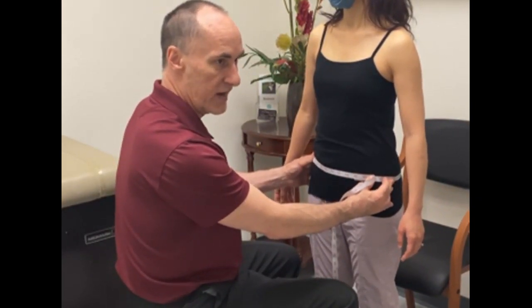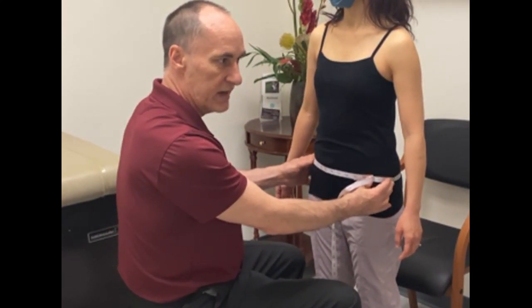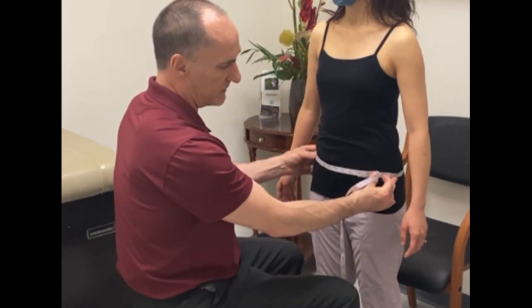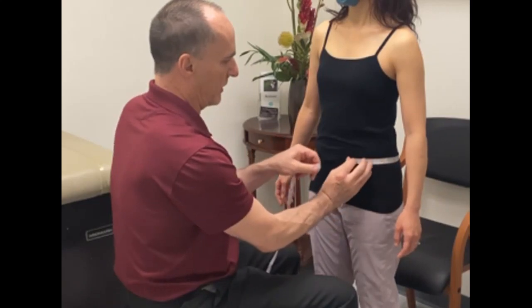Right at the level of the ASIS. The fourth measurement is your iliac, which should be halfway between the ASIS and the waist measurement. So if the ASIS is here and the waist is here, you want to be halfway between those two.